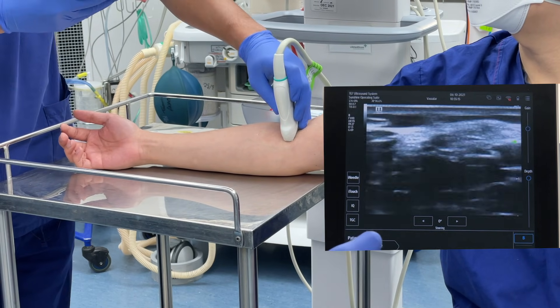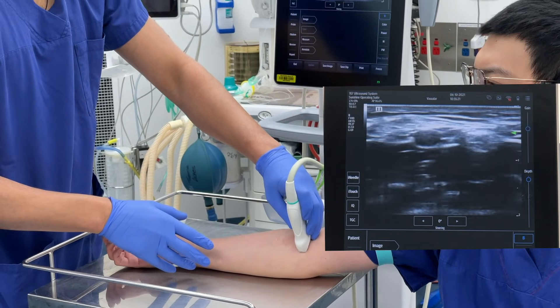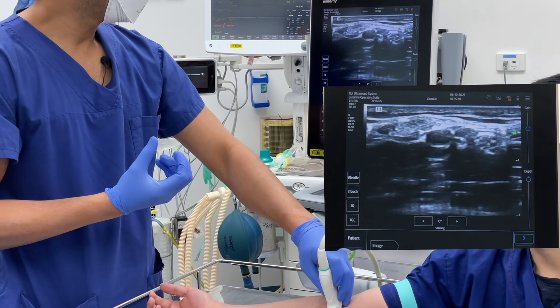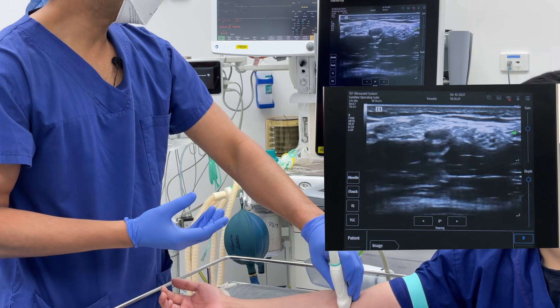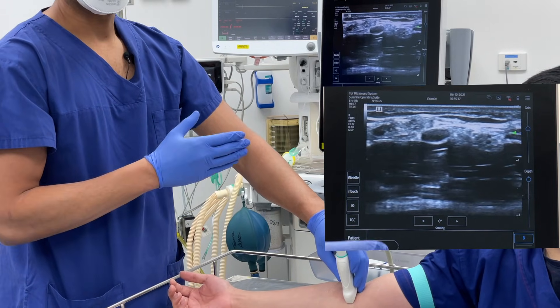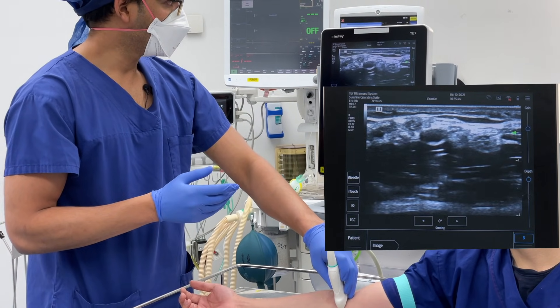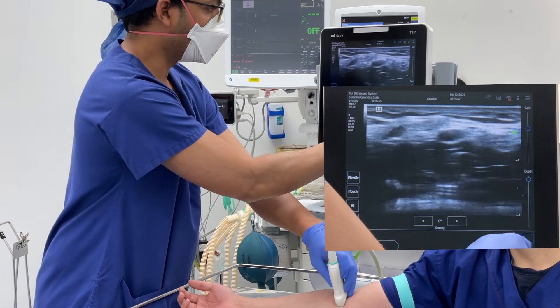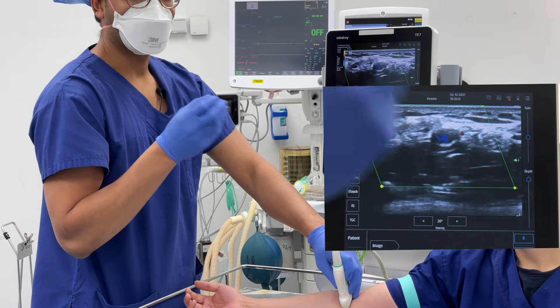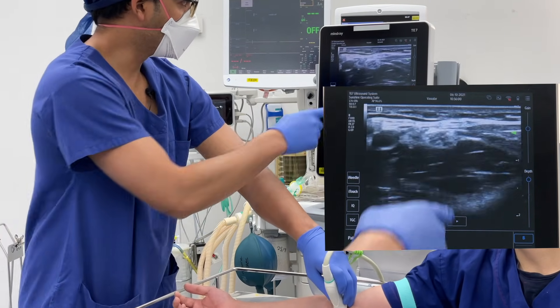It's very compressible — just pressing down gently and it compresses. Most importantly, it's not pulsatile. If this were an artery, it would be pulsatile. Now compare it to another structure over here — it's a bit deeper, and you can notice it's actually pulsating, so that's an artery. It is compressible, but the more you compress it, the more the pulsation shows up. That's a structure I definitely don't want for intravenous cannulation. If I put Doppler on this, you'd also see color pulsating through, confirming it's a pulsatile structure.